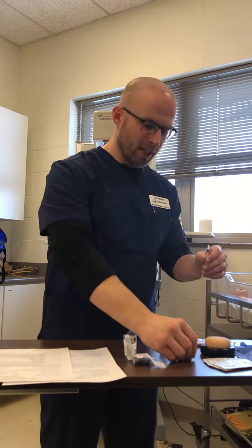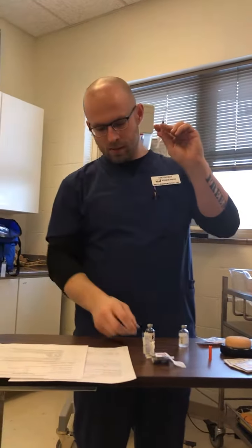Next step is we're going to uncap the needle. We're going to place the cap upside down to make it easier for capping. We're going to draw back 10, 20, 30 units of air.